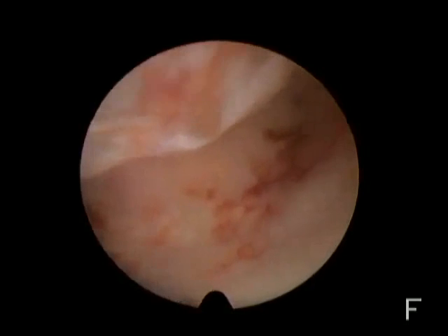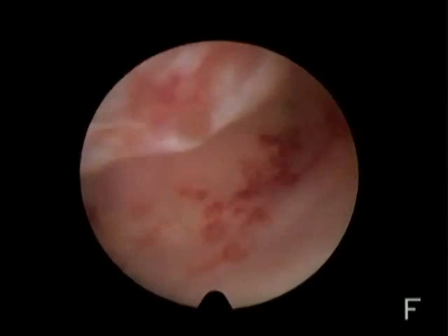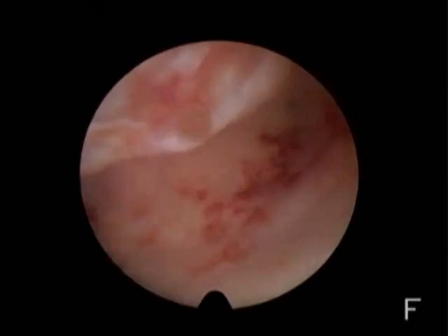Now I want you to pay attention to those lesions. You see these red lesions here? Well, actually, it's very probable that they are due to the cervix dilation. So it causes traumatic lesions, and then it makes it difficult to interpret. We don't know whether it's post-traumatic or something else. This is why it is always advised not to dilate the cervix. When we can, it's always good not to dilate the cervix. But in this case, I had no choice. There was a cervical stenosis.